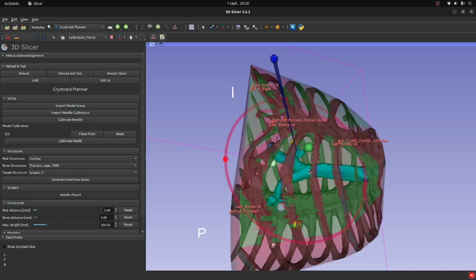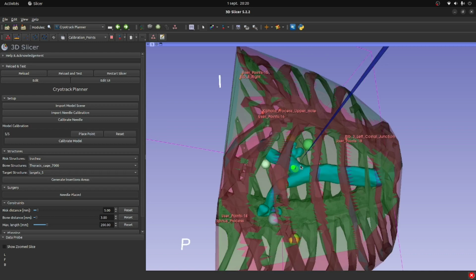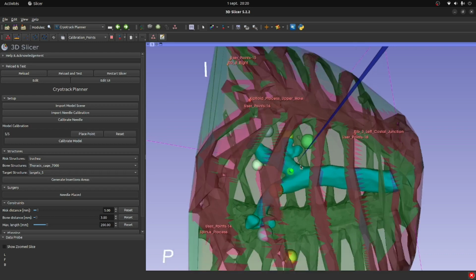Meaning that we have to align the needle with the trajectory from the needle tip to the target in order to make the ring very small. Once the ring is small, we can be confident that we are on the right path towards our target.